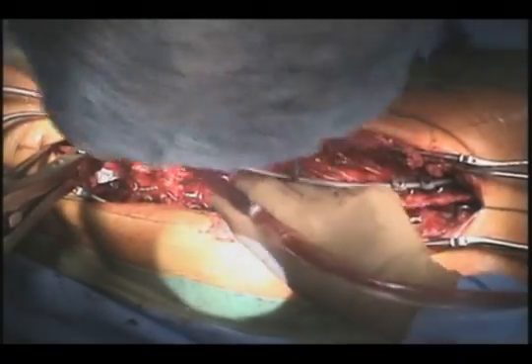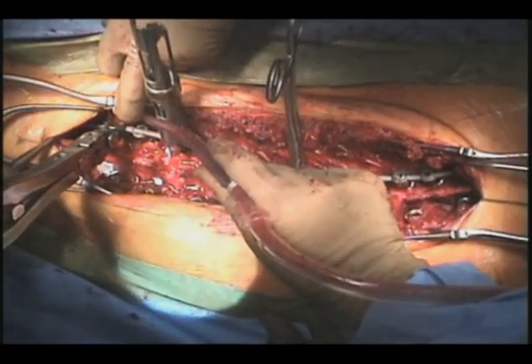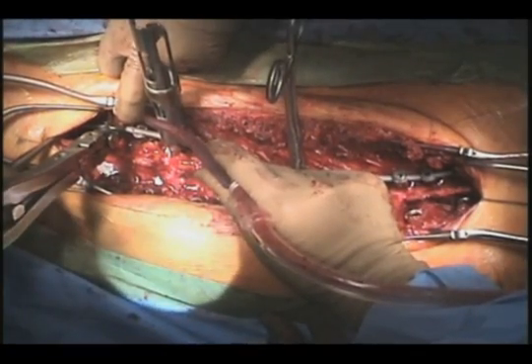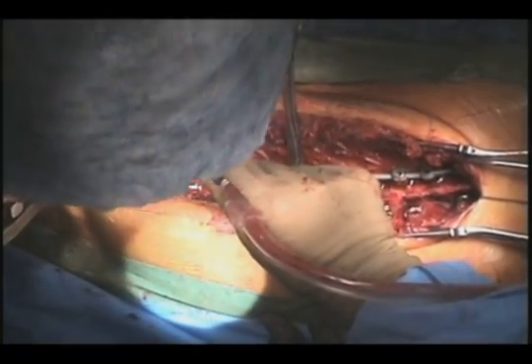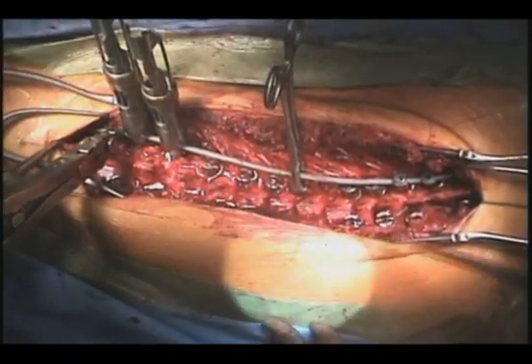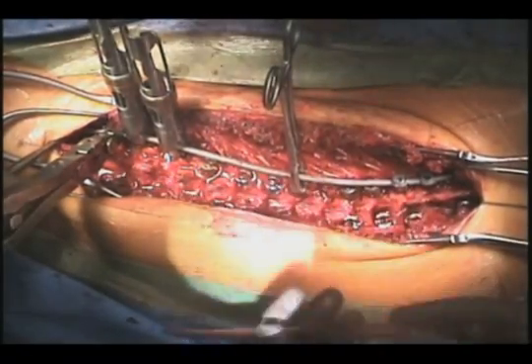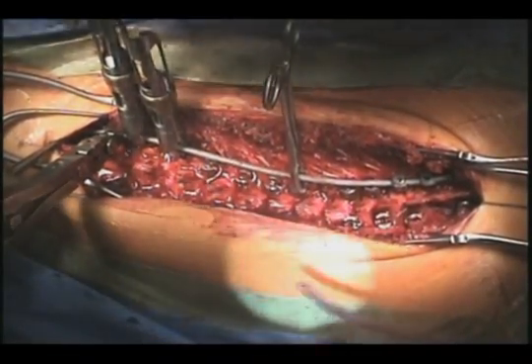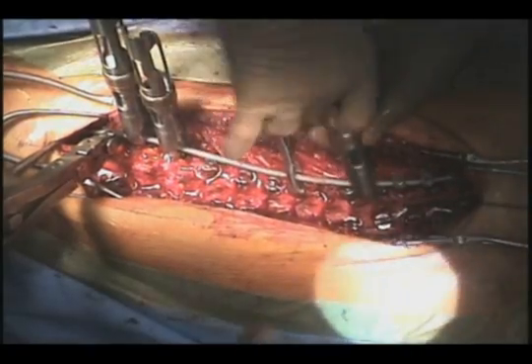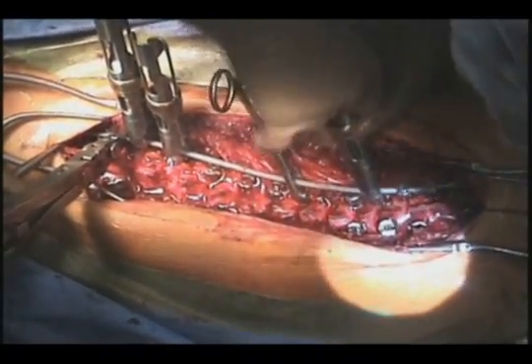And we do this segment by segment. We use these clips which help us with reductions. These clips allow me to attach to the pedicle screws through a top-notch feature, and then I use a reduction screwdriver that introduces the set screw down and reduces or brings the spine to the rod and reduces the rod into the screw head.